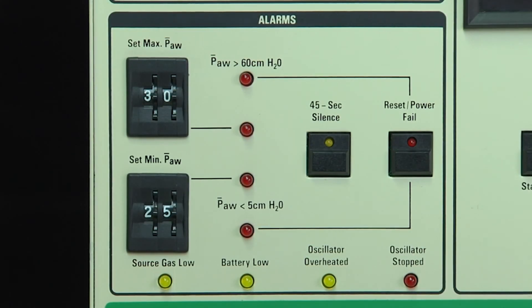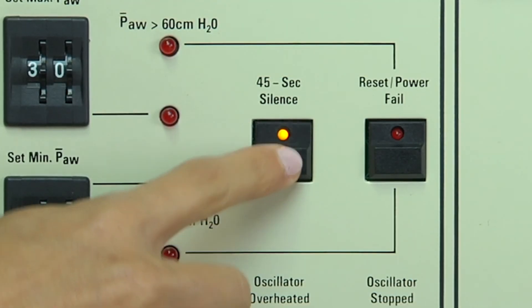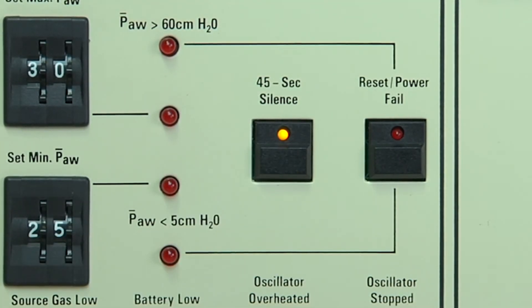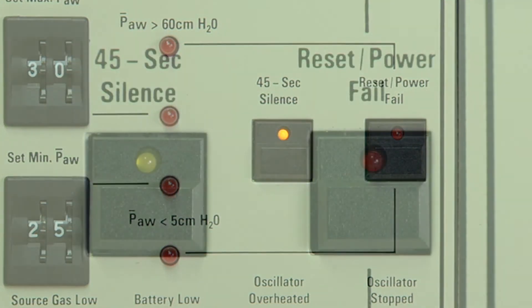The alarm silence push button silences all audible alarms for 45 seconds. Once activated, this button illuminates a yellow LED. The alarm silence will remain active for the full 45 seconds.